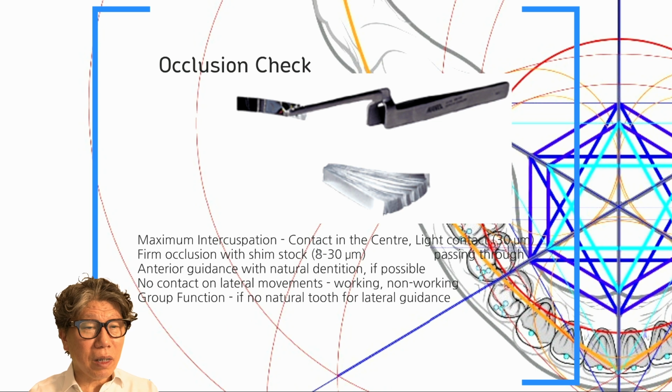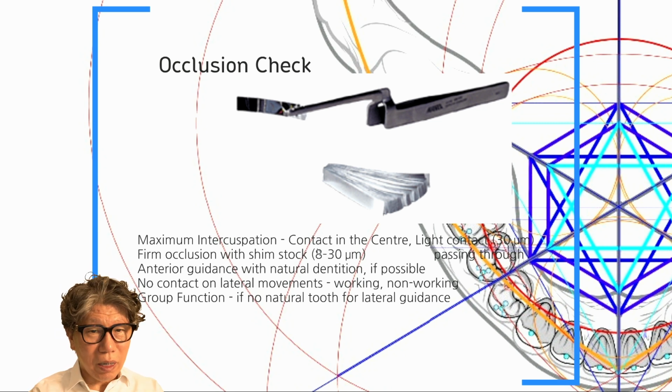What about high spots? Called a bullseye, the center is punctured so that there is no occlusion mark, and the surrounding area appears red. Around high spots, it appears in red or blue. Anyway, what shows up on the occlusion paper is called a bullseye. This term also actually came from the US and abroad. Since the field of dentistry itself originated from abroad, many terms are in English.